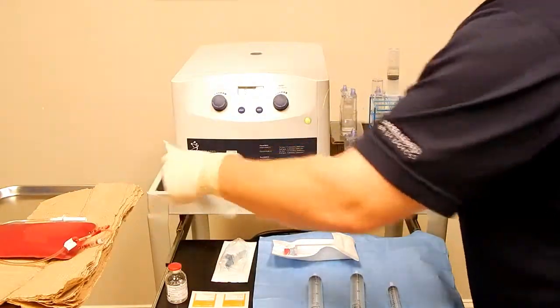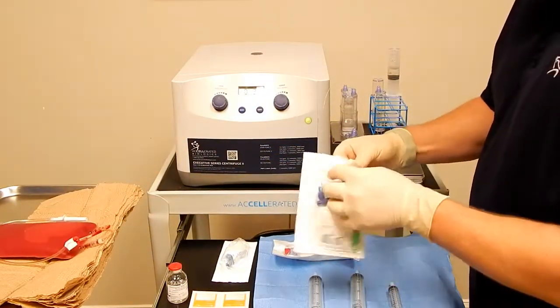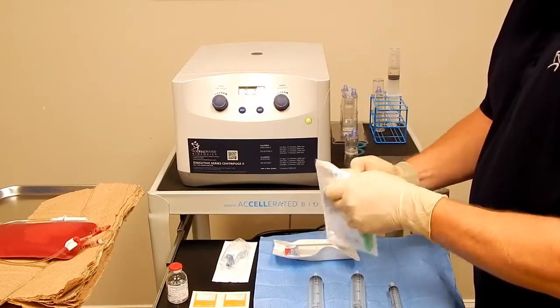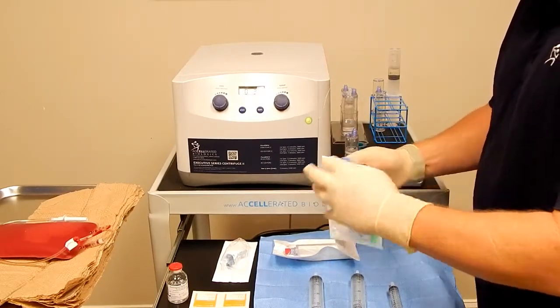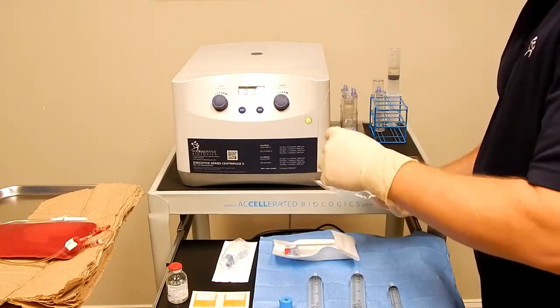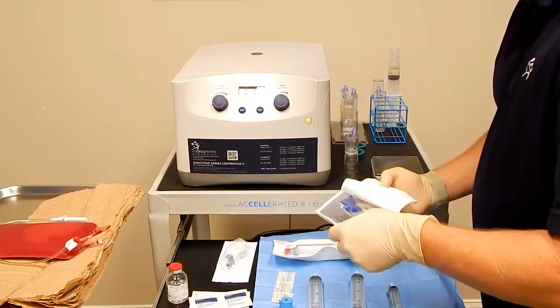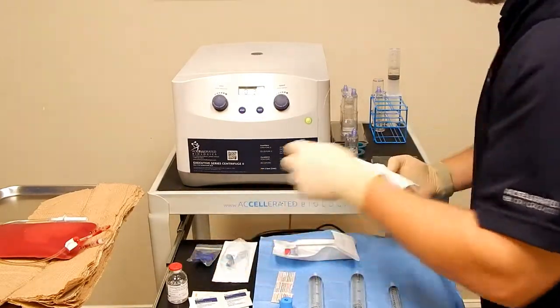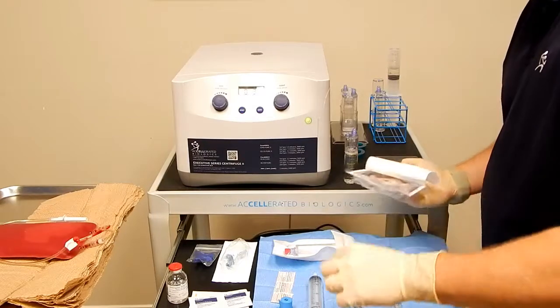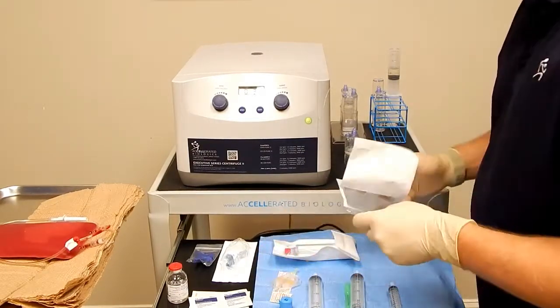First thing we'll use is our blood draw accessory. In here you will have your tourniquet, more alcohol swabs, band-aid, some gauze, sterile caps, filter needle, and a 19 gauge butterfly needle.